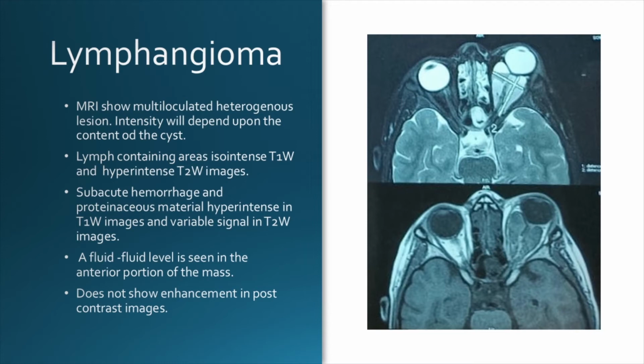What does the fluid level indicate? Ma'am, the different content of the lymphangiomas, so lymph, more proteinaceous content and cystic lymphatic content. So the proteinaceous content will be down. It's more indicative of an intracystic hemorrhage or a bleed. The lymphangiomas do not show enhancement on contrast imaging.